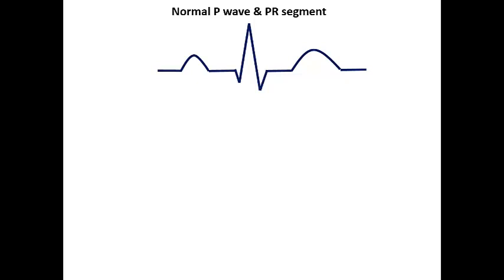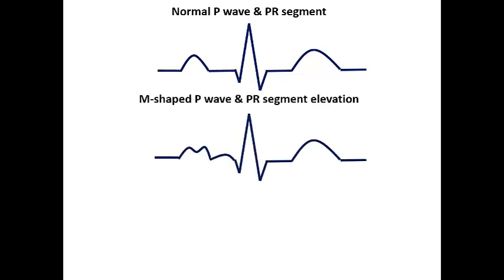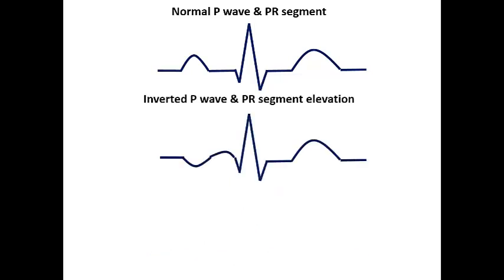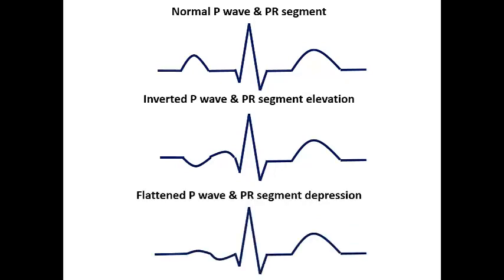Here is an example of atrial infarction. The P wave has a change in morphology — it is M-shaped — and the PR segment is slightly elevated compared to the TP segment. Another example shows low amplitude and slightly irregular P wave shape with PR segment depression, suspicious of atrial infarction. Another example shows an inverted P wave with PR segment elevation. And here we see a flattened P wave — or in some cases a disappearing P wave — with PR segment depression.